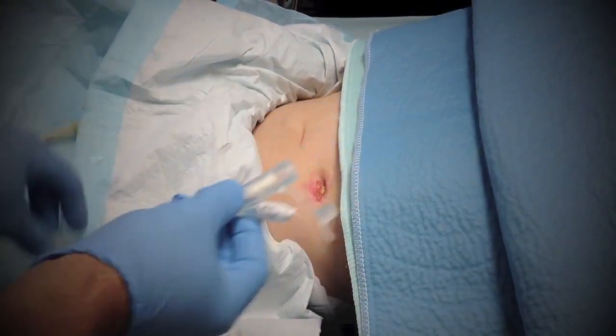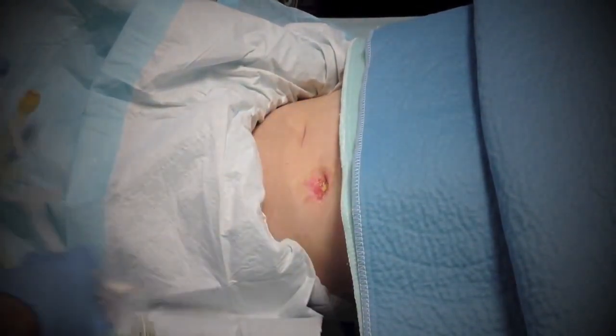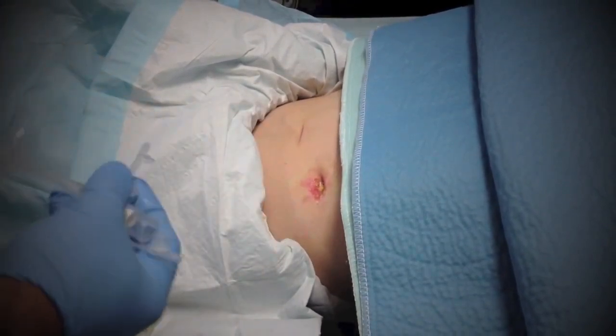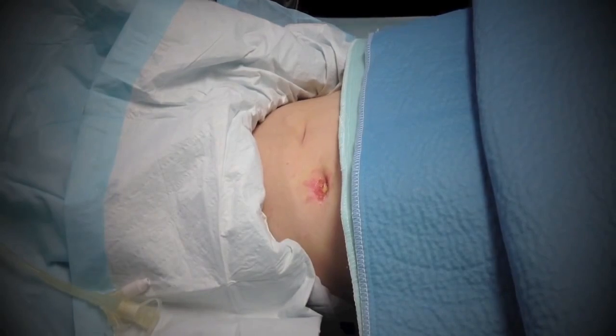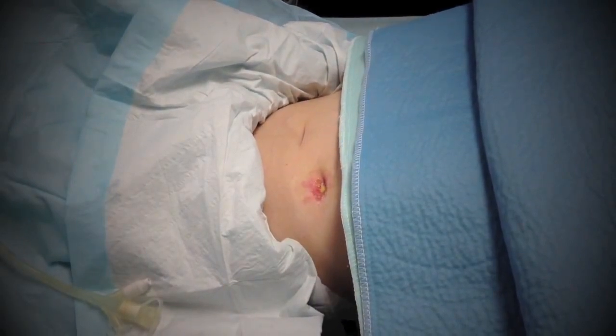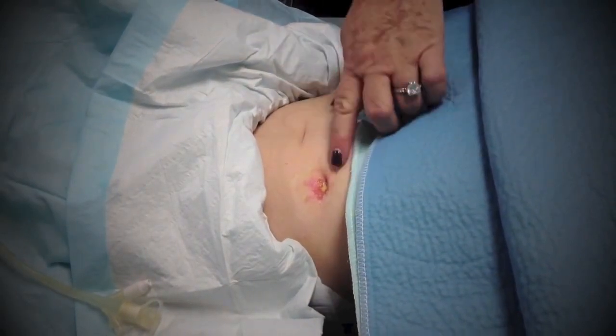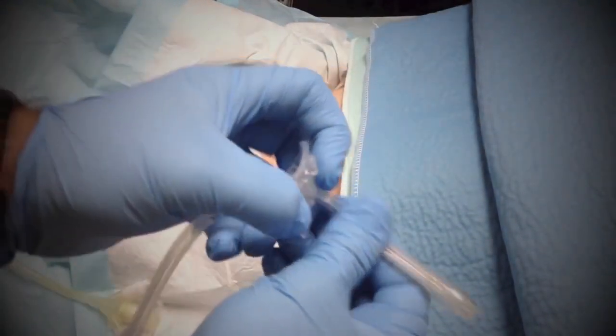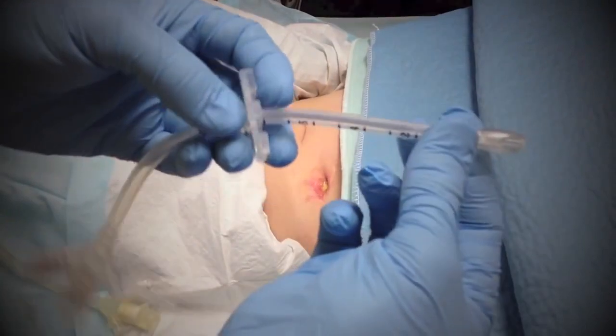So 20 French. And you can see the colors change over time. It just changes colors and stuff like that. Did you give her formula this morning? A little bit. Oh, that's what that is then, isn't it? That's formula? So this little thing here moves around.